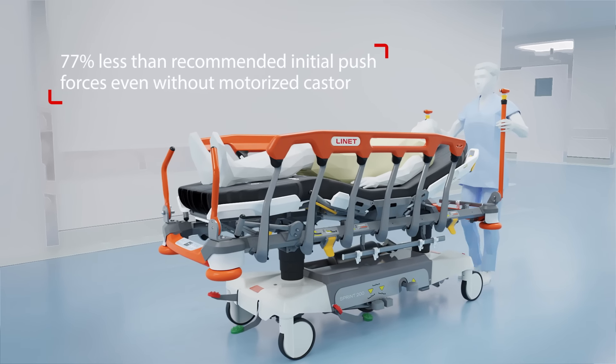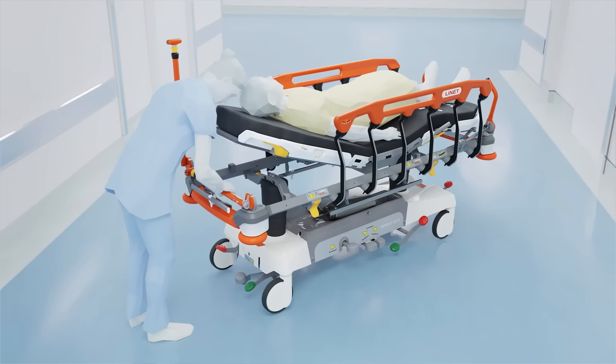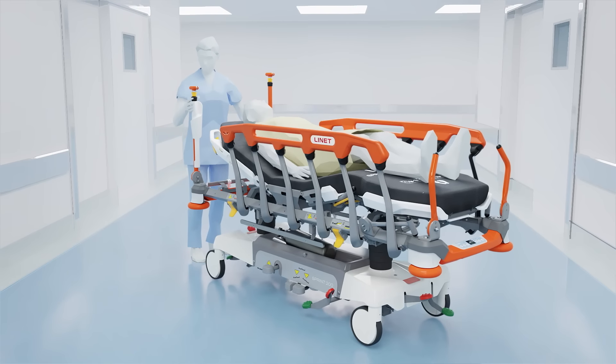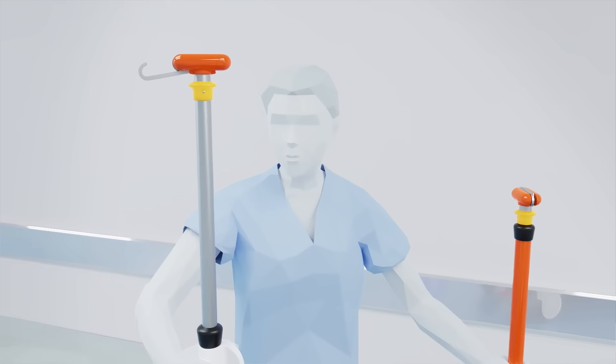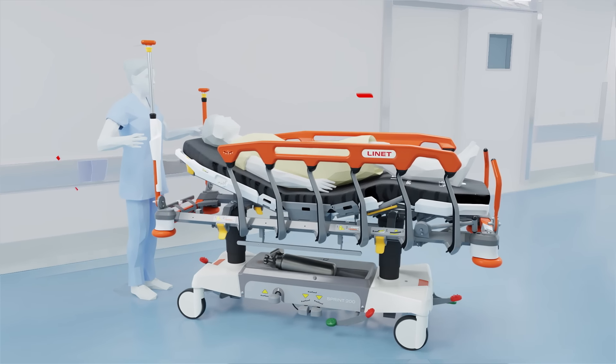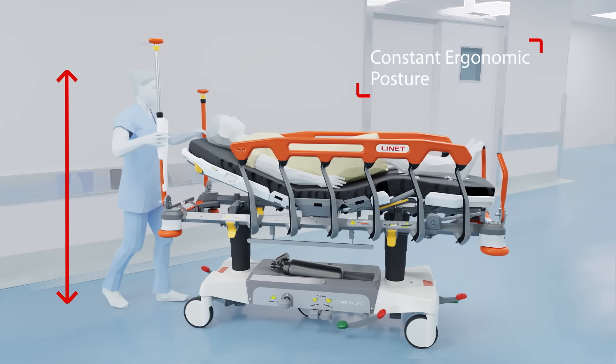Even without power, the stretcher can be pushed easily. With the innovative iV-and-drive concept, iV poles and push handles are merged together so that one can push the stretcher from any height without compromising ergonomic posture and without risk of damaging iV poles.